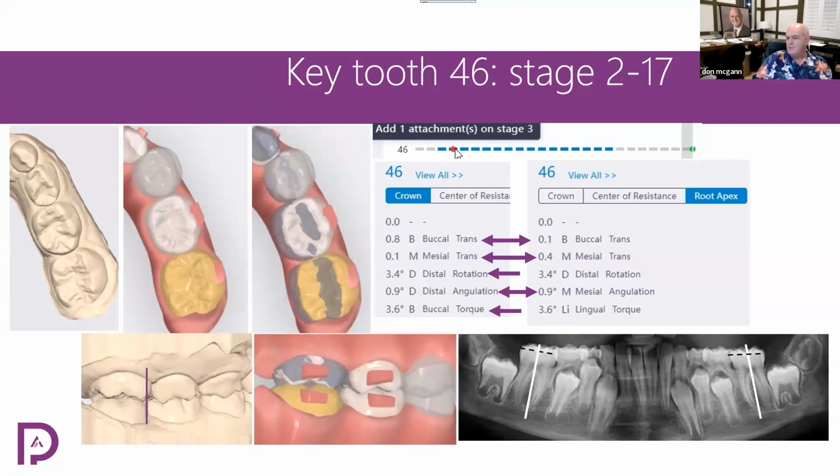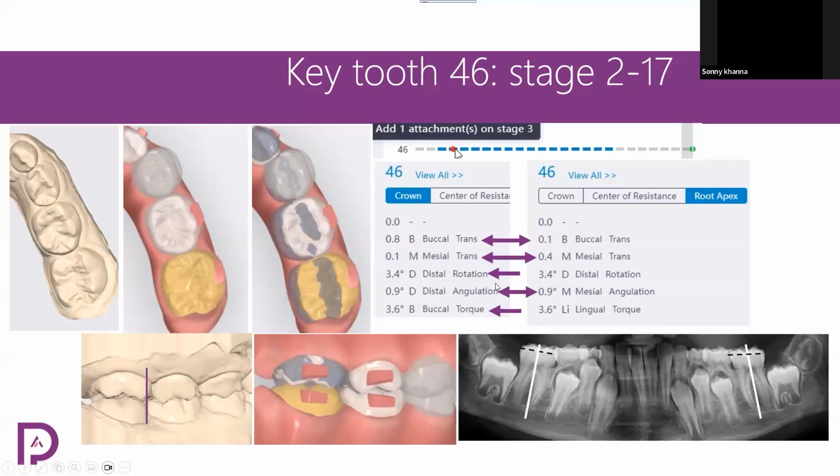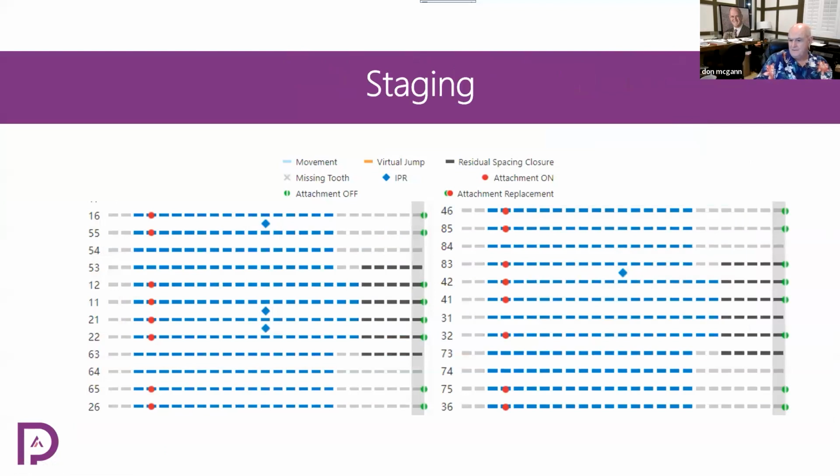So if you want more lower space, you could choose to, in this case, where is it? Let's see. Mesial trend. So the molar's going forward a little bit. Distal rotation. Okay, distal angulation. Here it is right here. Distal angulation. That would be called mesial root torque or distal crown torque, right? Okay, not much. You can be much more aggressive in a different case.